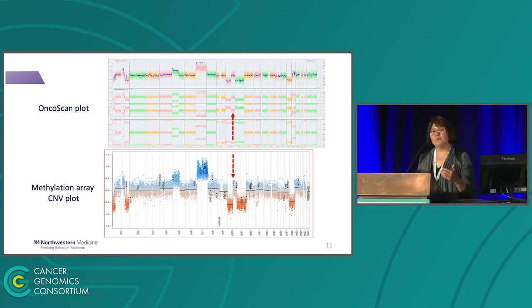However, and that's the reason why I particularly like OncoScan a lot. It helps a lot with understanding the mechanism of tumorigenesis, because you probably notice immediately the difference in pattern. Look at 10q. There is a loss of heterozygosity, right? You see the loss of heterozygous tract. So this is copy neutral loss of heterozygosity, which was not picked up by copy number assessment from methylation data simply because we don't have enough SNP probes for reliable detection.